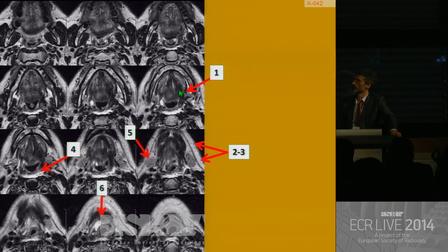This is retracting, so this must be fibrosis, post-RT fibrosis, which is always seen as a result of healing of the part of the tumor which was growing deep in the tissues. When you have a nasopharyngeal carcinoma, the vegetating part simply disappears after radiation therapy, but what is left of the infiltrating part is some kind of hypointense scar, as in this base of the tongue.